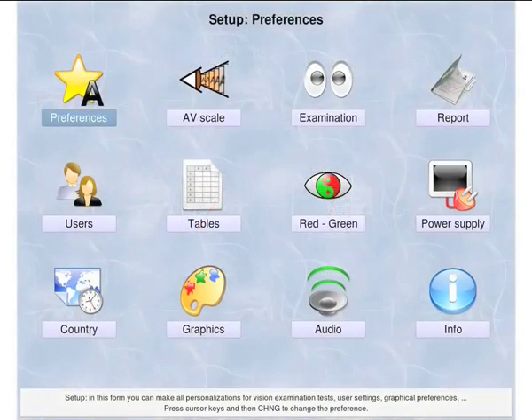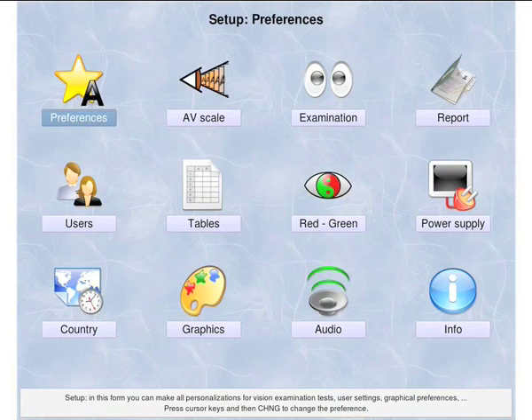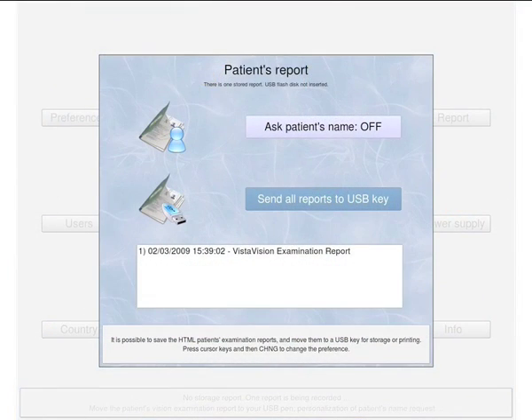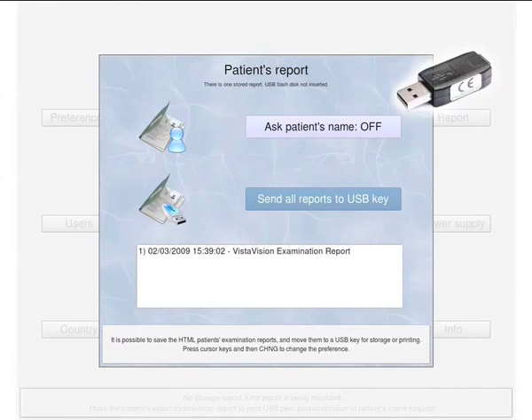By opening the setup window and the report sub-window, it is possible to display the stored reports that you can easily transfer to a USB key by inserting it into the VistaVision.